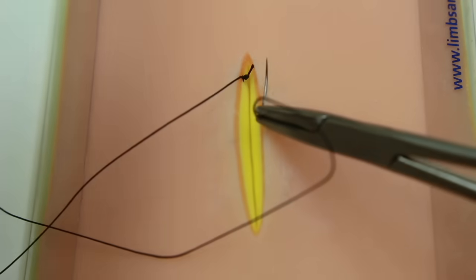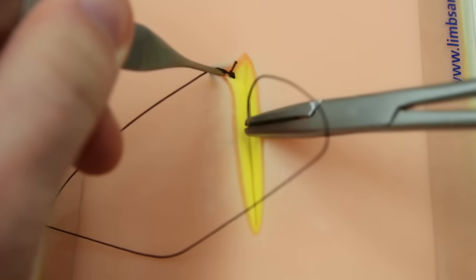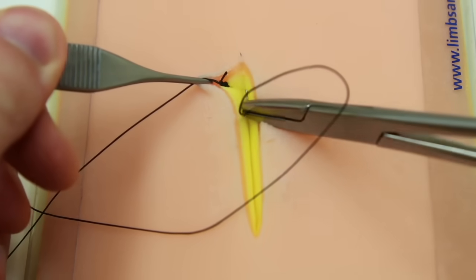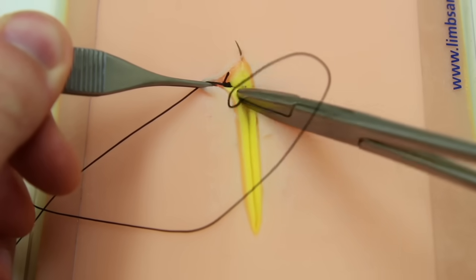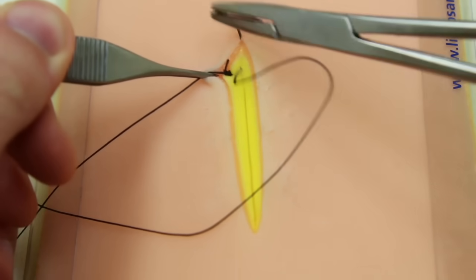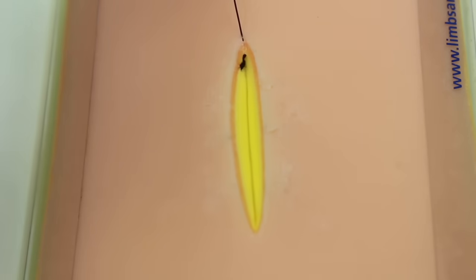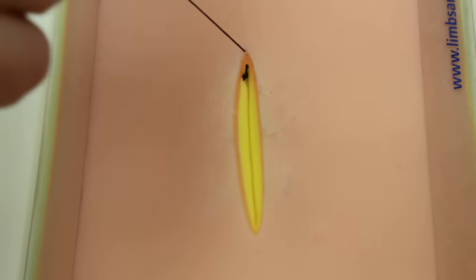Reload away from you. Grabbing the skin edge, going in the dermal layer, then right out the apex of the incision at the dermal-epidermal junction. In this case, transition from kind of a deeper pink to a lighter pink.